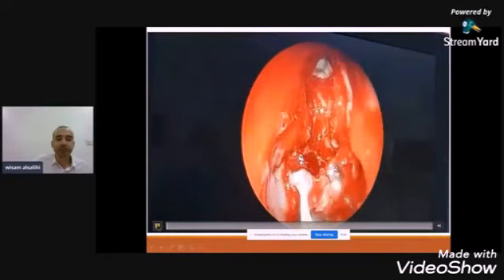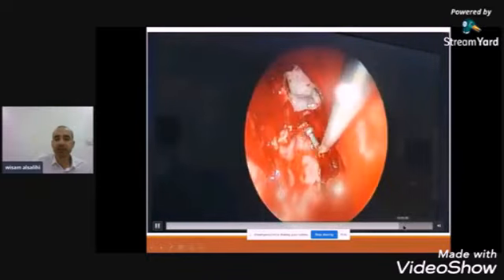This video shows injury to the anterior ethmoidal artery.